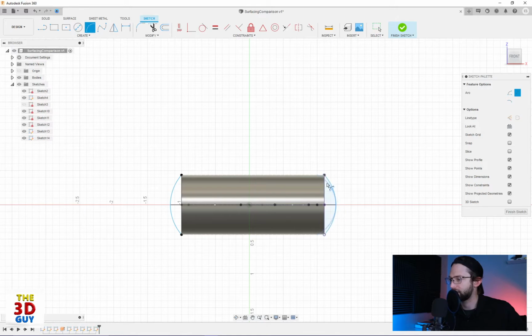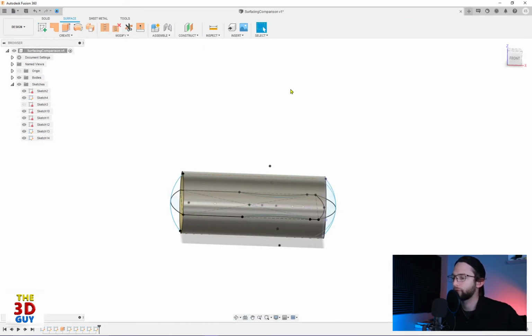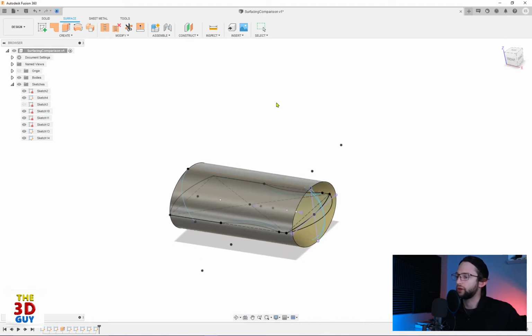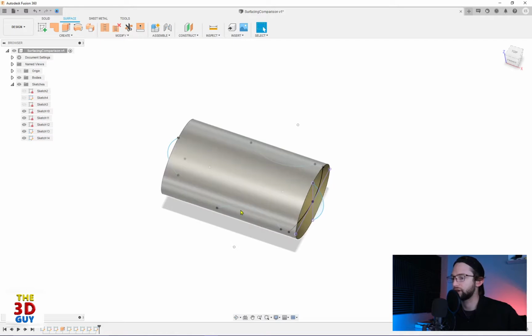So this sketch, that arc right there, you can actually see I misplaced. So it's good that we're doing this anyways. Okay. So we have that new arc. So let's delete that so we can see clearer. We'll get rid of that. Awesome. So you can see we have all those different lines that we'll need. And we'll still need to add that other arc right there at some point.